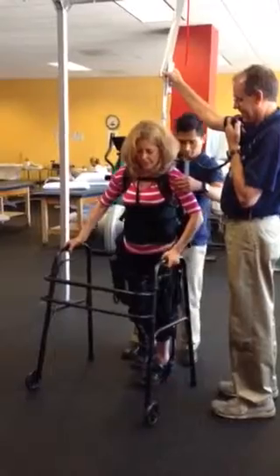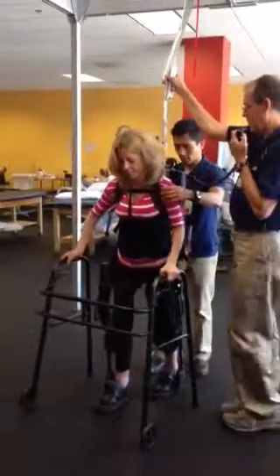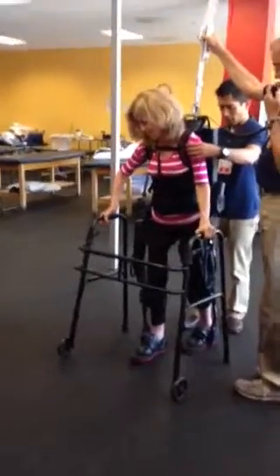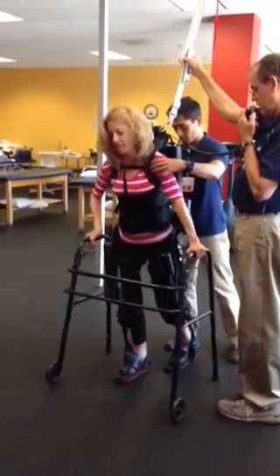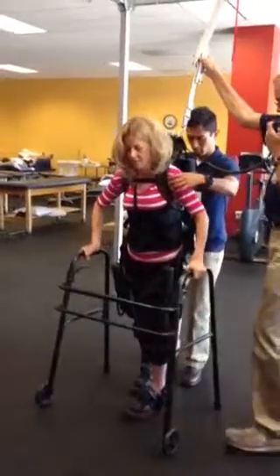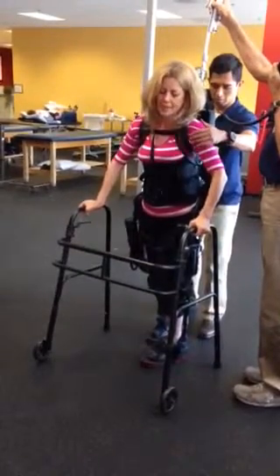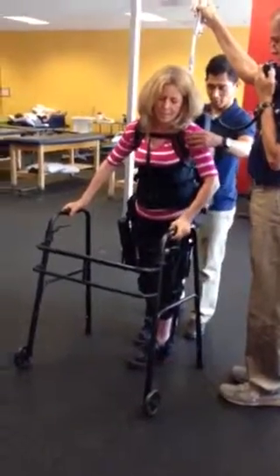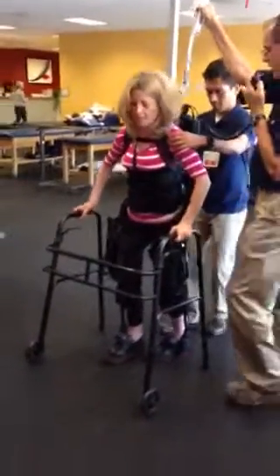That's better. Step. That's better. Step. Good — walker. Now let's get over that right leg. You're leaning to the right — that looks good. Now lean forward some more. I can help you. Right there. Step. Walker. Good. Lean left. Go closer to the walker and you feel more. Feel better? Yeah. That's where you want to be. And step. Good.